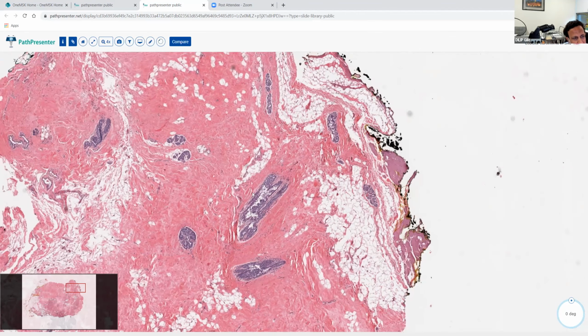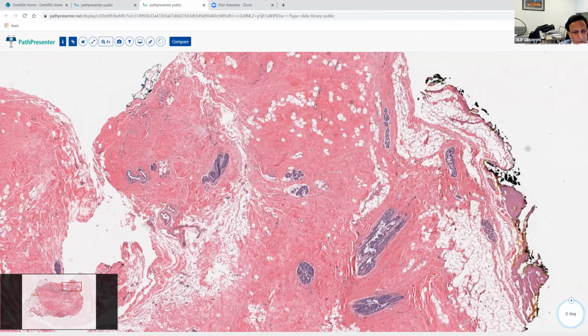This kind of isolated LCIS is not even necessarily regarded as cancerous. It is considered a risk factor for future cancer development. That is why nowadays, for isolated LCIS on core biopsy, they don't do any surgery, because the whole breast may have small foci like this and you will never get around it anyway, and there is not much risk involved. But in other situations, generally speaking, they will be associated with a mass or calcifications. The picture will be different.